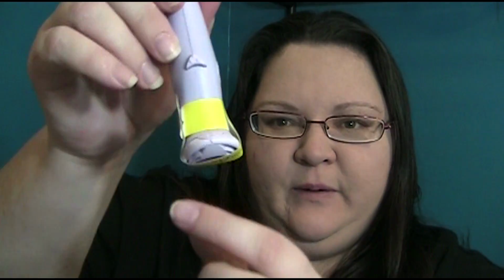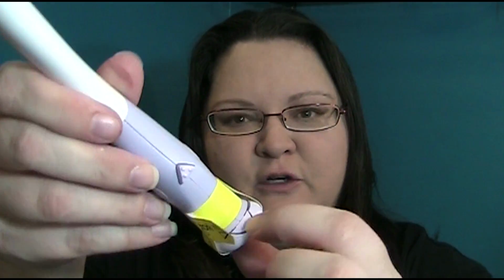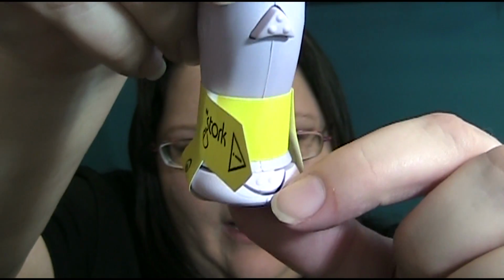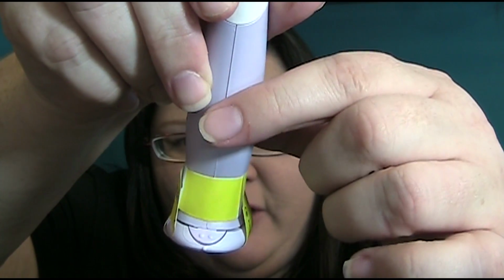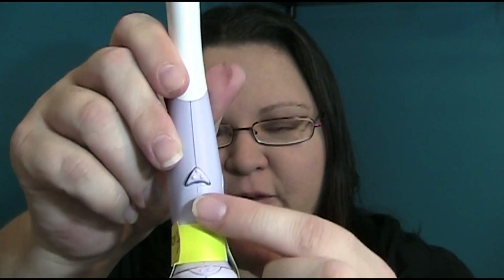And then what you will do is you will pull back on this plunger. It will pull back, and then you will, no more than a 45-degree angle so you don't spill anything out of it, insert this into your vagina. You will hit the 2 buttons. See, it all has little knobs. So that's 3 and that's 2. This will release the petals up here for the cervical cap. The plunger will push it into place, and then the 3 dots will release the cap out of the device altogether. So the 2 buttons release the prongs. You push it inside. 3 buttons release the cap, and then you pull this out and the cap stays up there.